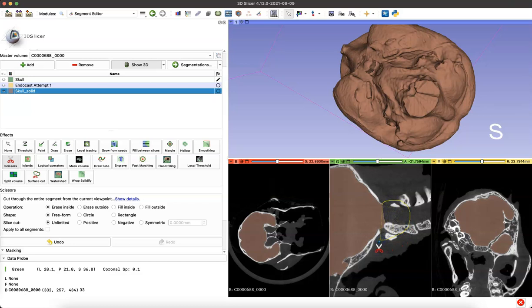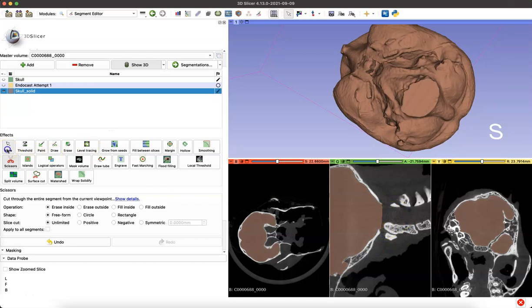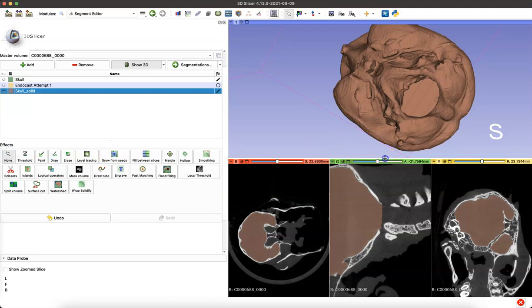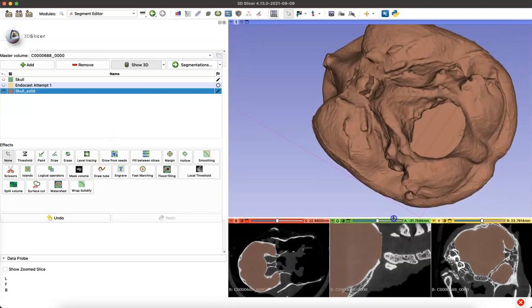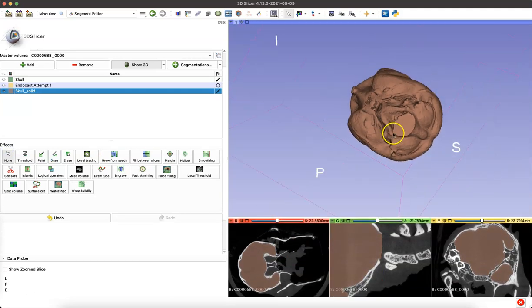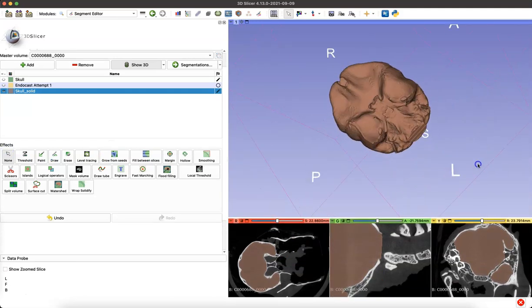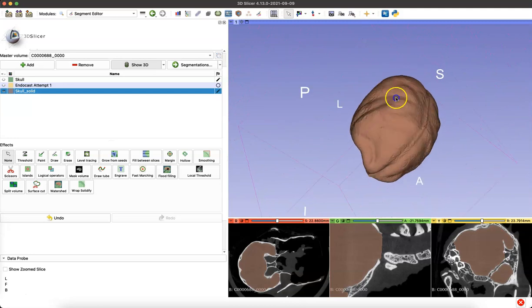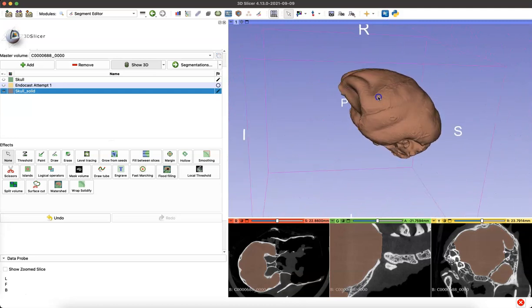From the outside edges of the skull on both sides, you can just cut with the scissor tool so that it makes more of a clean line across the foramen magnum. But you could develop whatever protocol works for your lab and your project.